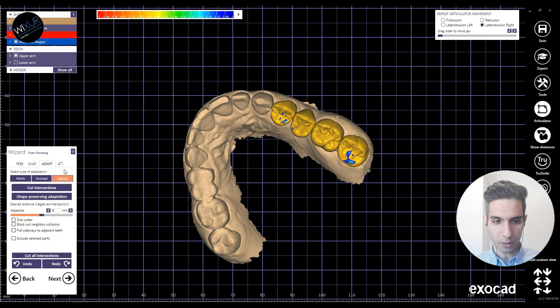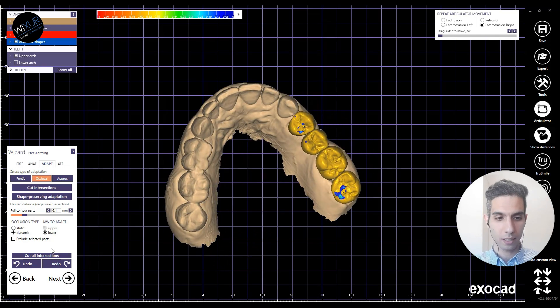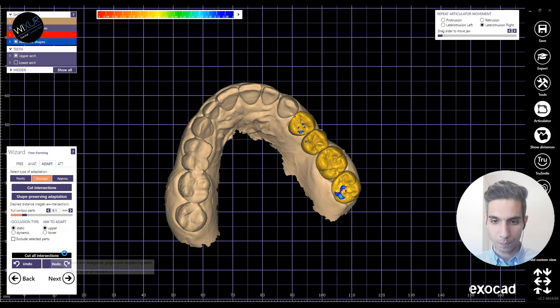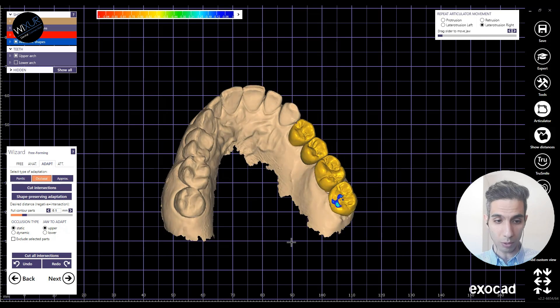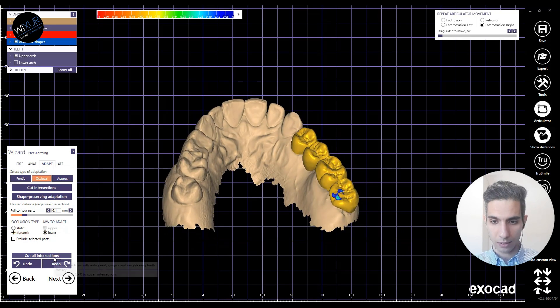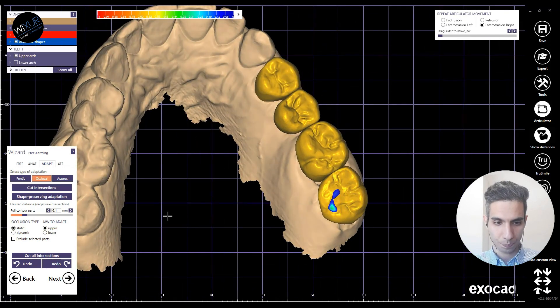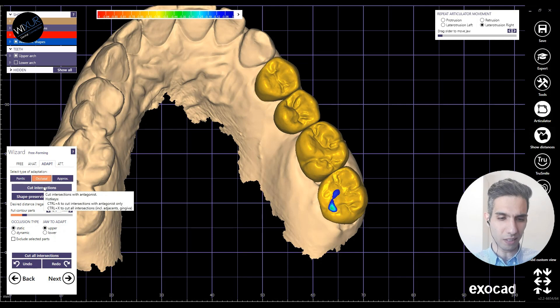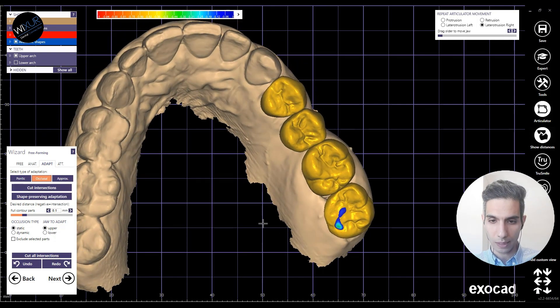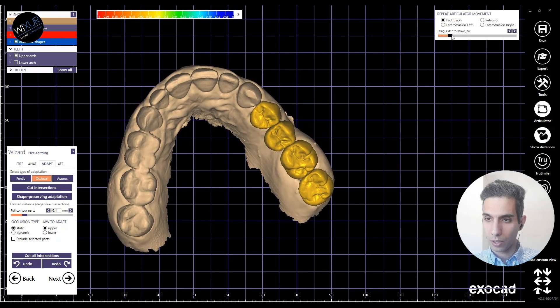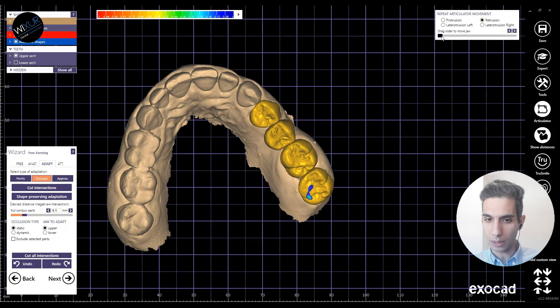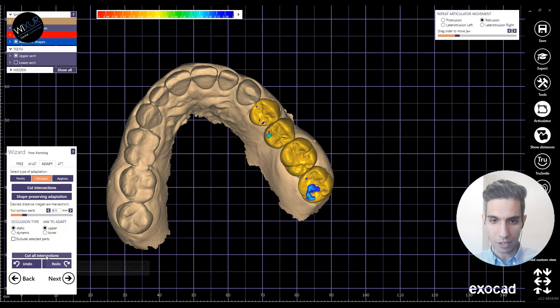Now in the adaptation tab we have an extra option: dynamic adaptation — dynamic occlusion check with the upper jaw. Let's do some intersection cuts. In the second molar I can see that for the lingual cusp I can't go further — this is the minimum thickness. I assigned the minimum thickness in DentalDB at 0.5mm, so that's a reasonable limit. During the retrusion movement I see some cusps with intersections, and I'll remove them with the 'cut all intersections' button in the adaptation window in free-forming.